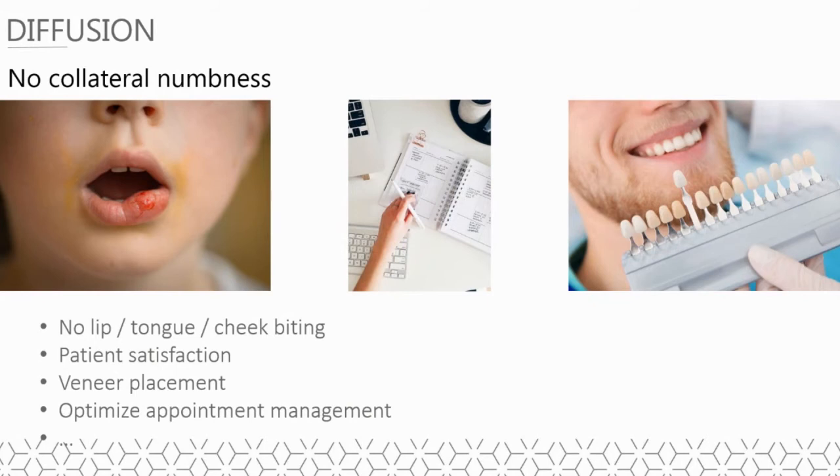You can also optimize appointment management. Indeed, it is very rare for most dentists to perform bilateral ID blocks in the same appointment due to the postoperative side effects of the anesthesia. With intraosseous anesthesia, you can perform multiple quadrant treatments as you know the patient will not feel the anesthesia.